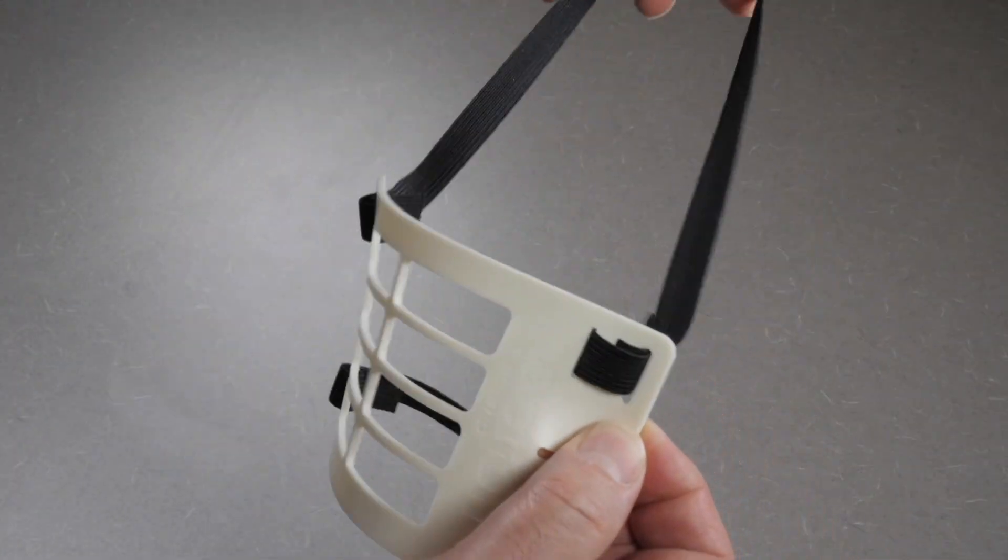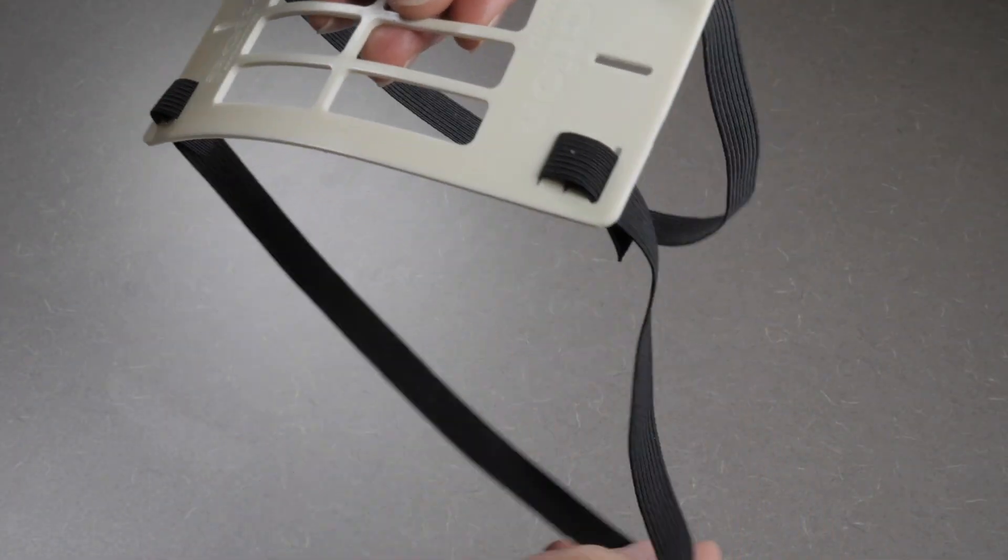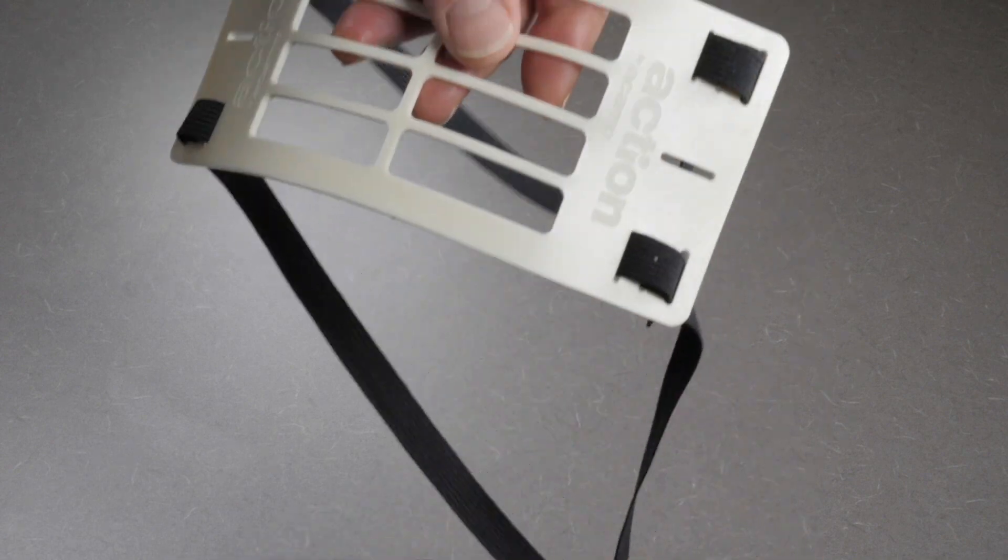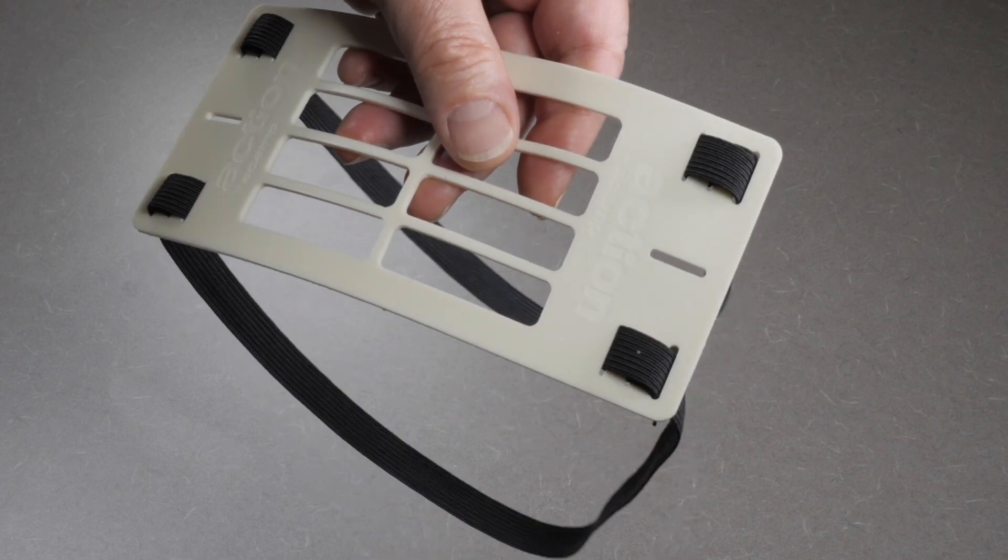The upper strap for the top of your head is cinched on the top two corners, while the lower strap for the back of your neck is cinched on the bottom two corners. Once the straps are in place, you are ready to proceed to the next step.